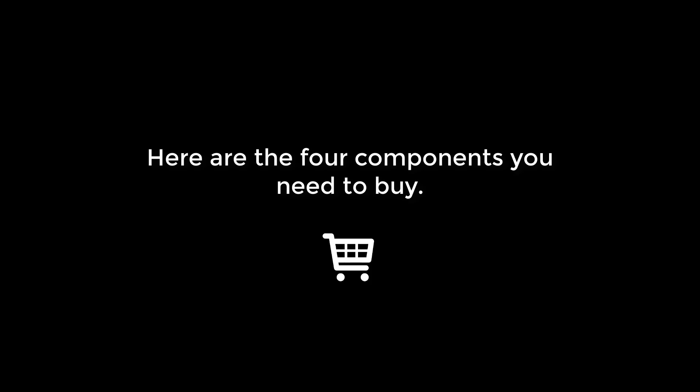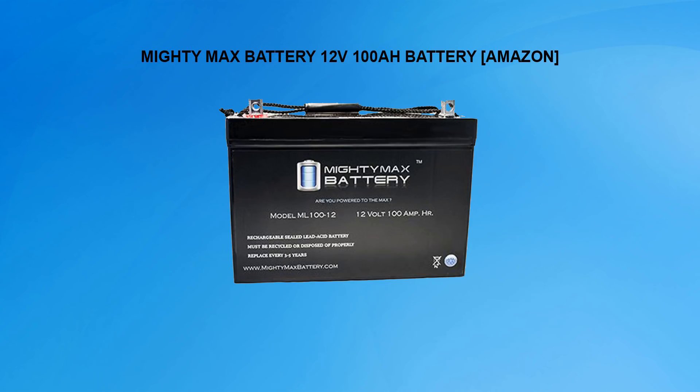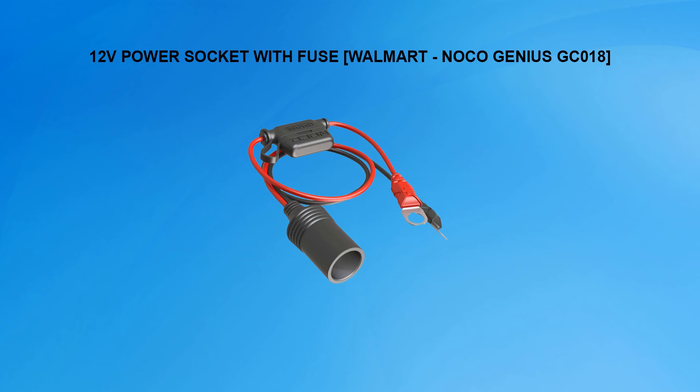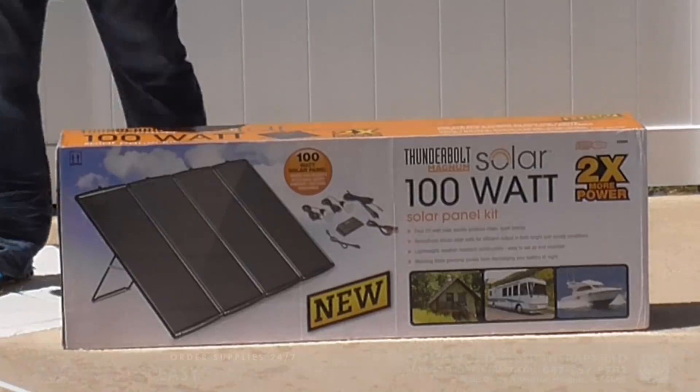Here are the four components you will need: a Thunderbolt Magnum solar panel kit, a Mighty Max 12-volt 100 amp-hour battery, a 12-volt power socket with fuse, and a pair of wired mini battery clamps.